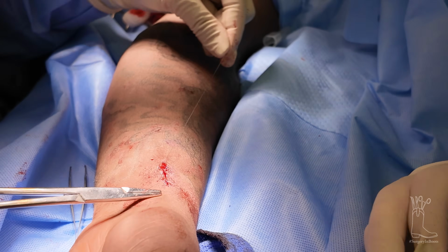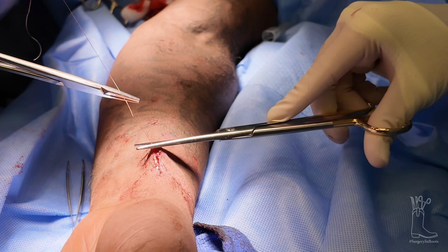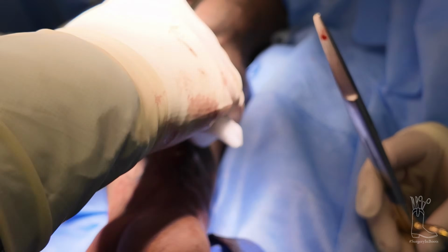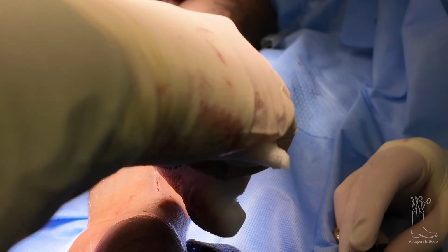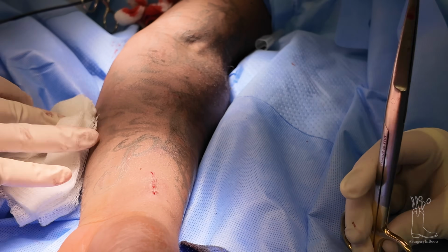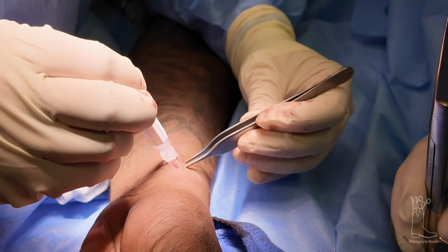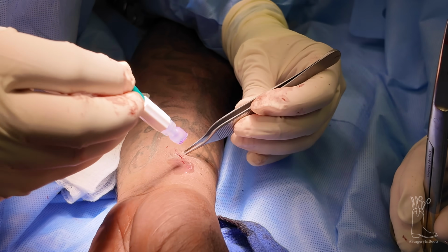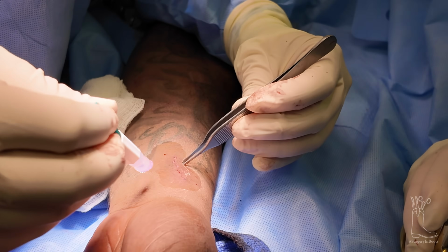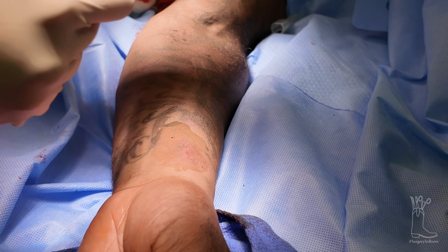So yeah, now we got it closed up, and it looks a heck of a lot better than it did before. And after we kind of looked at it a little further, it looks like he may have ruptured his radial artery, and that's what all of this was about. We did an Allen test, as our PA reminded us, where you clamp one side and see if you still have flow and capillary refill, and he does. So he has the same flow that he did before, but that explains the aneurysm, that explains the ganglion cyst, all in one diagnosis. So it's probably a radial artery aneurysm that traumatically occurred when he fell. I can't remember what he said he was doing when he fell.